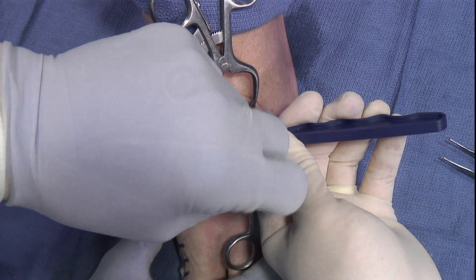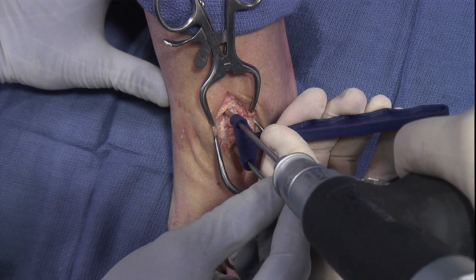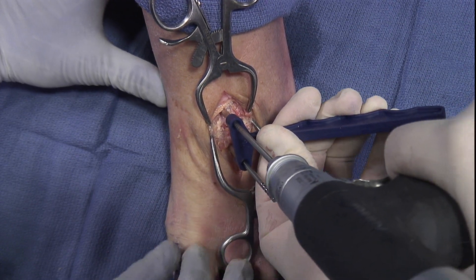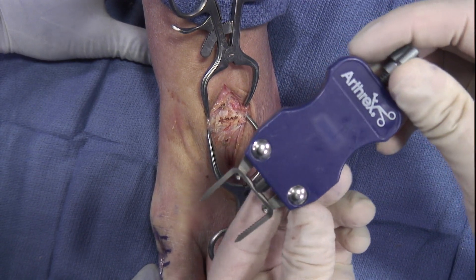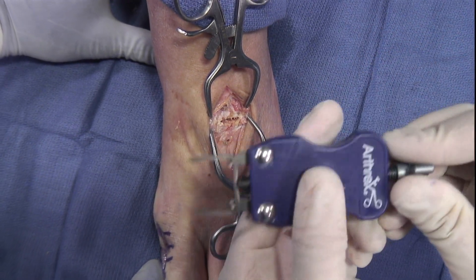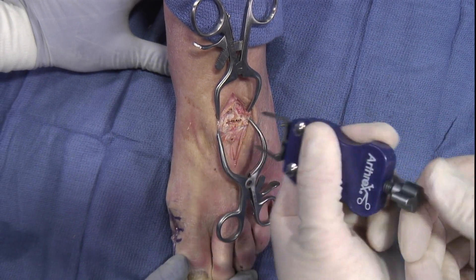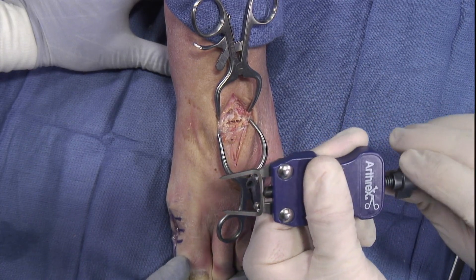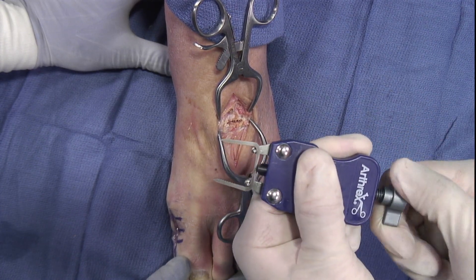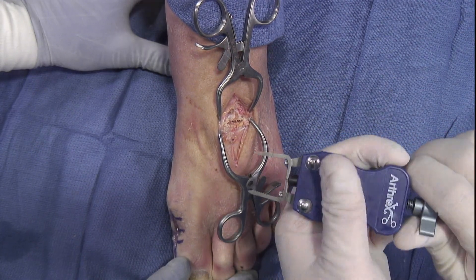Got a retention pin here just so we hold it in place, and then here's our second placement. Here's our staple — it comes preloaded out of the disposable kit, can be adjusted here, loosened if needed by turning counterclockwise, and then tightened and spread apart by moving it clockwise to get the appropriate width of the staple that you want.